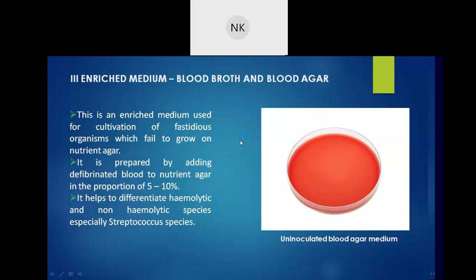Then what is the enriched media? An enriched media contains nutrients required to support the growth of a variety of organisms, including fastidious organisms. It allows the growth of a wide variety of microorganisms, and generally it is a solid media, because we also have another kind of media, that is enrichment media.